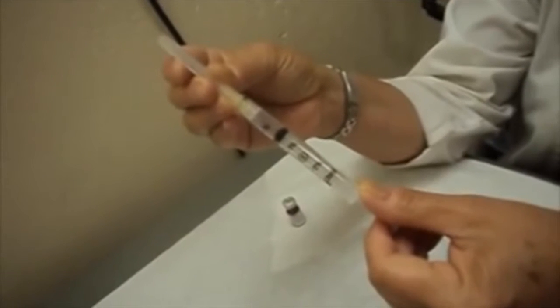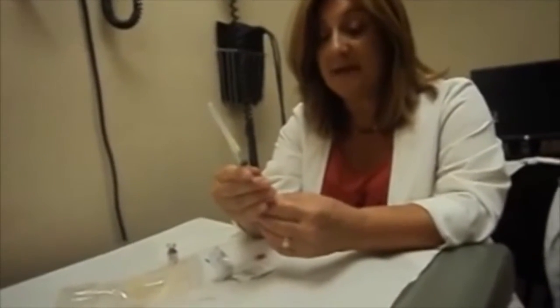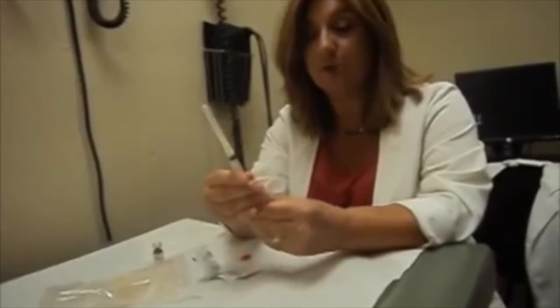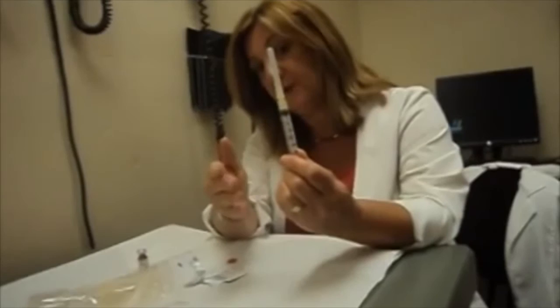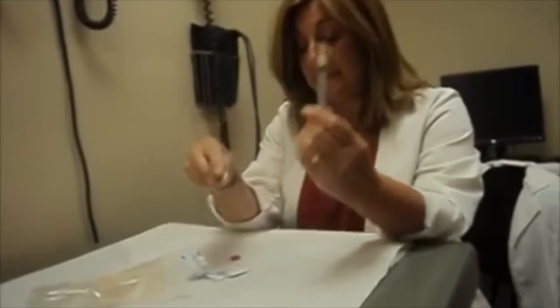And as you can see, I've drawn up 1 cc of air. For the one-dose vial, I'm not going to put as much air because it creates too much pressure. So I'm just going to put about 1/4 of a cc just to get the flow into the bottle. So your bottle is cleaned.